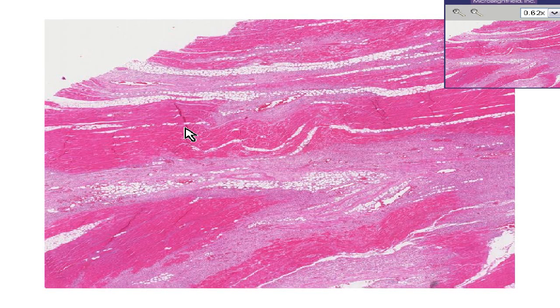Here is another myocardial infarct slide. You will remember that we showed one slide in which the myocardial fibers were infiltrated by neutrophils, and we called that acute. You will remember another slide in which we saw an extreme amount of dense fibrous connective tissue between the fiber bundles, and we called that remote or healed. Well, this case is called recent, so this is the intermediate stage.